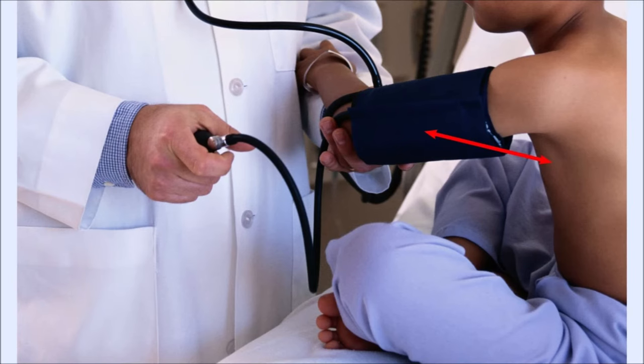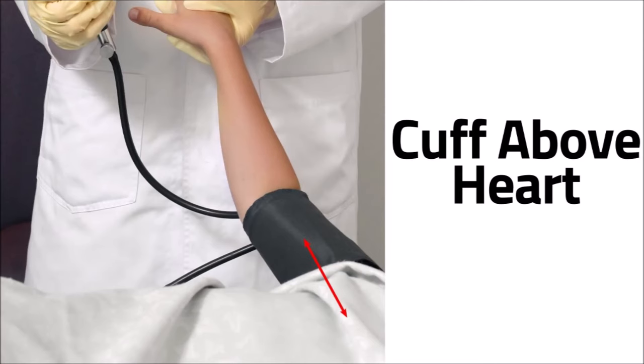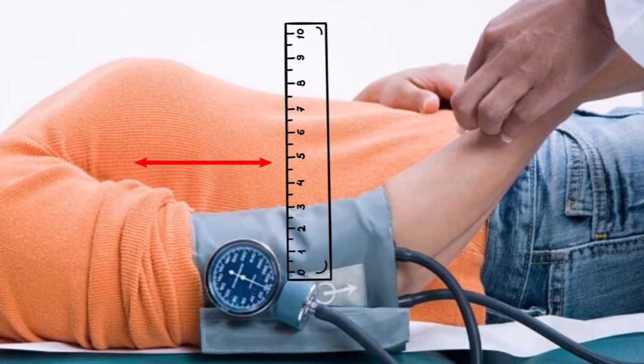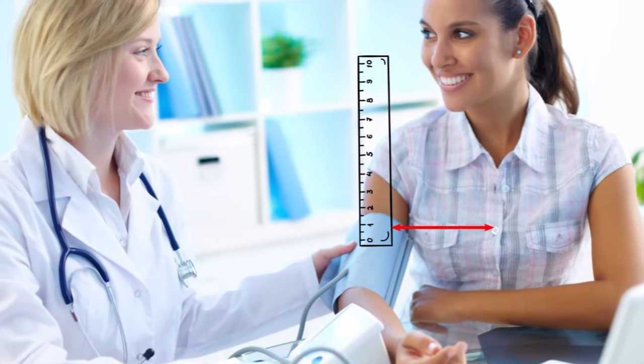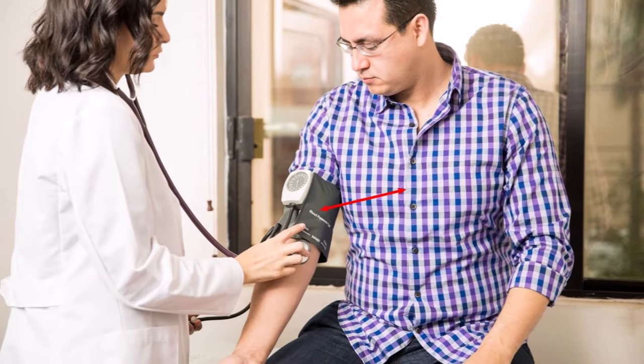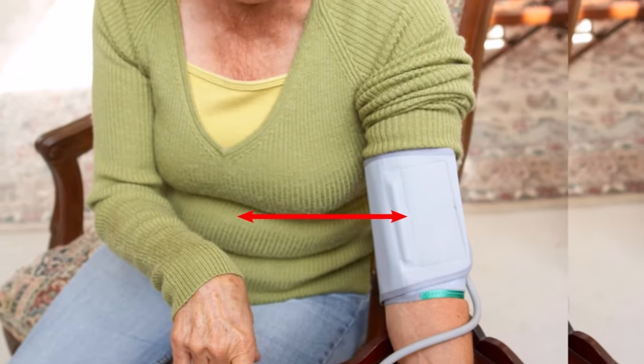If your arm is positioned so the cuff is above your right atrium, your blood pressure will read lower. For every inch your arm is higher or lower, your measurement will differ by about two millimeters of mercury. If your arm is positioned so the cuff is lower than your heart, your blood pressure measurement will be higher.